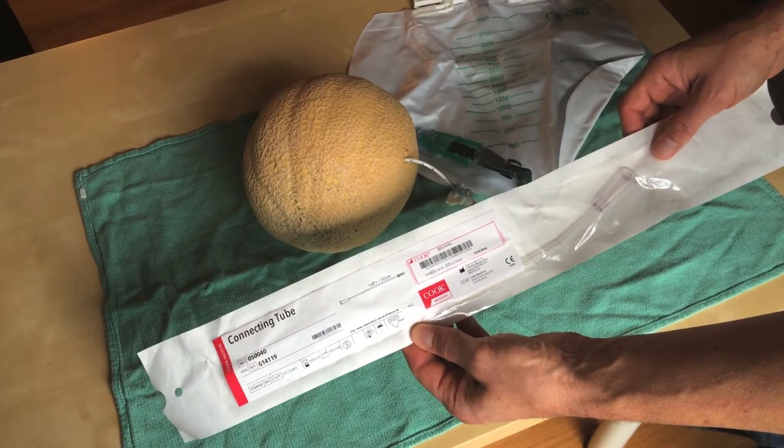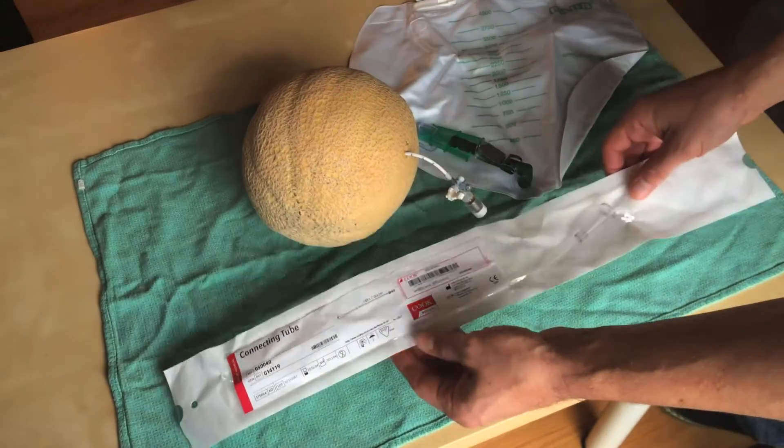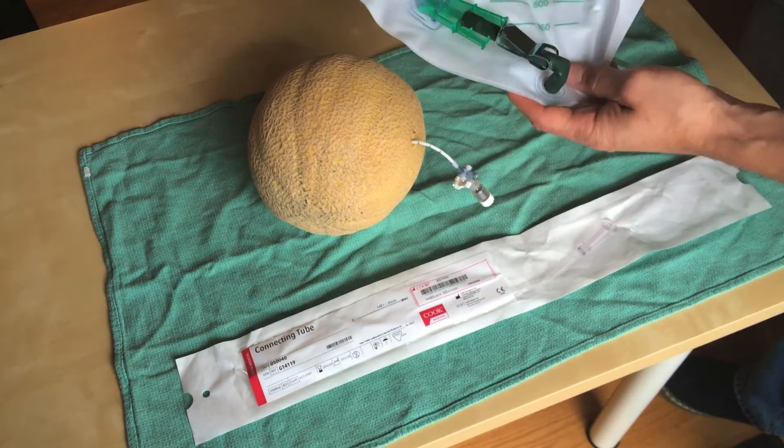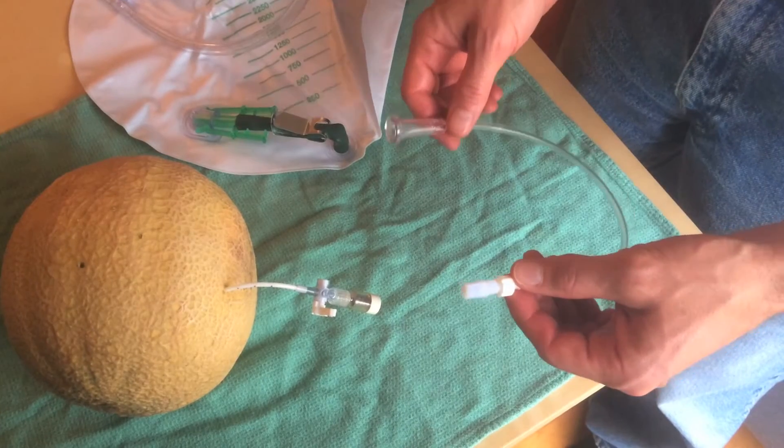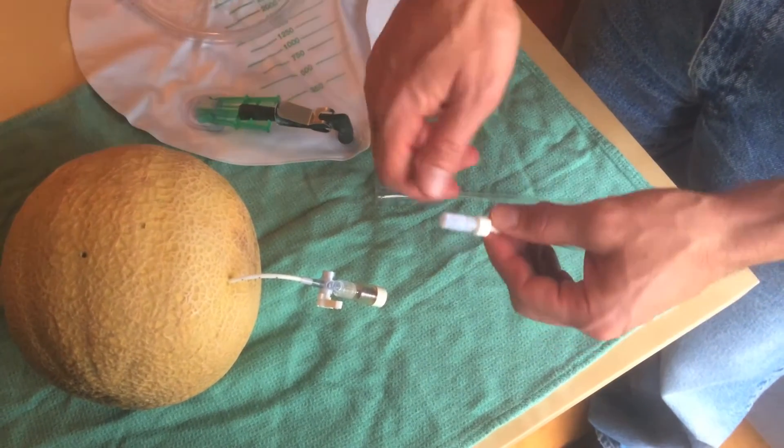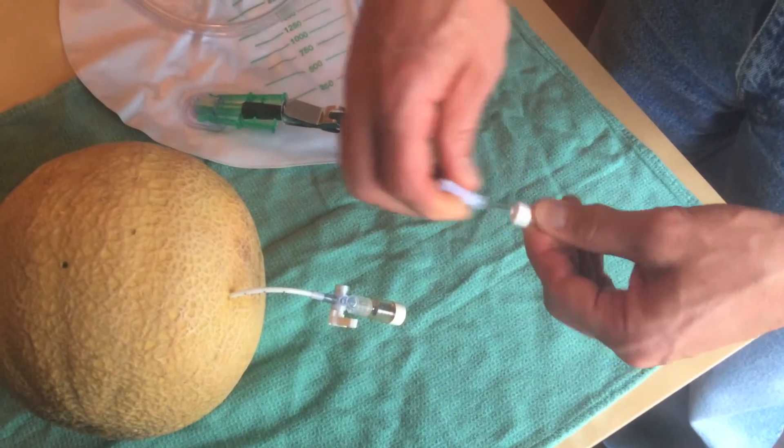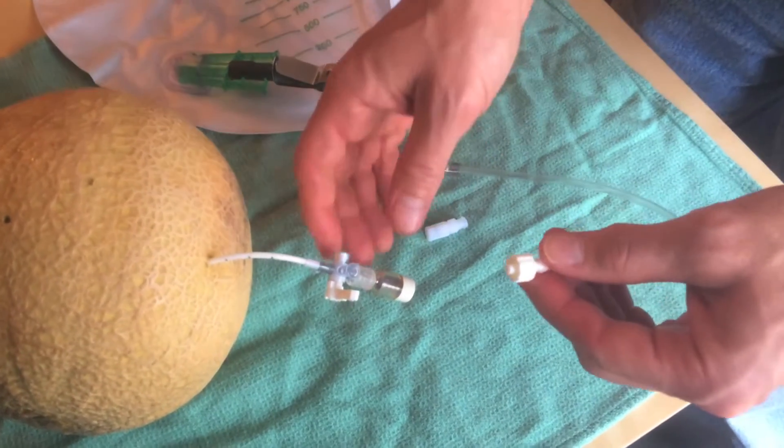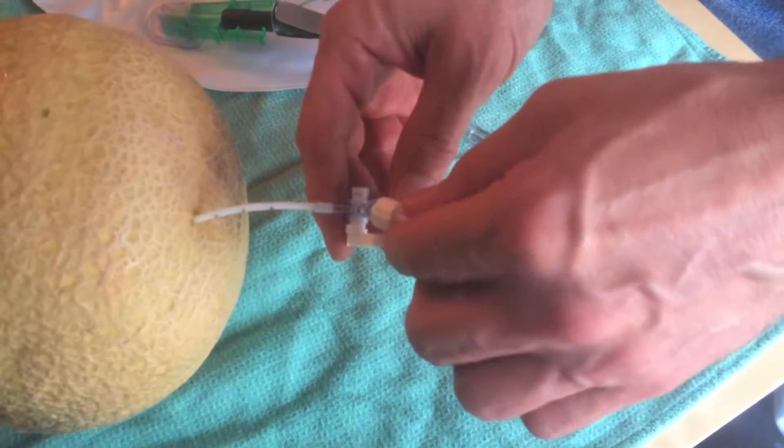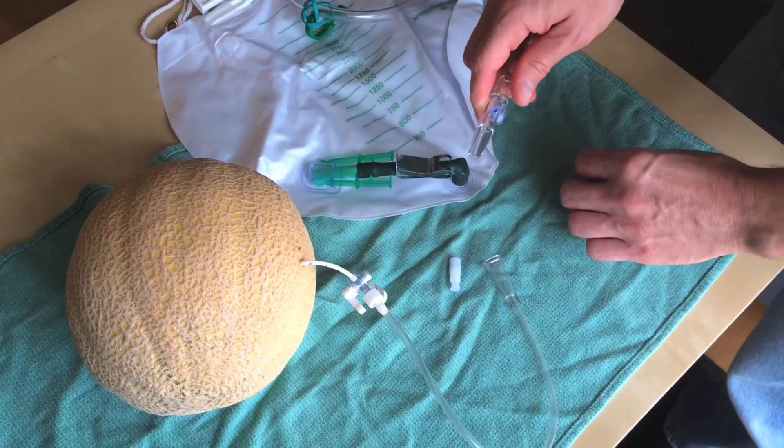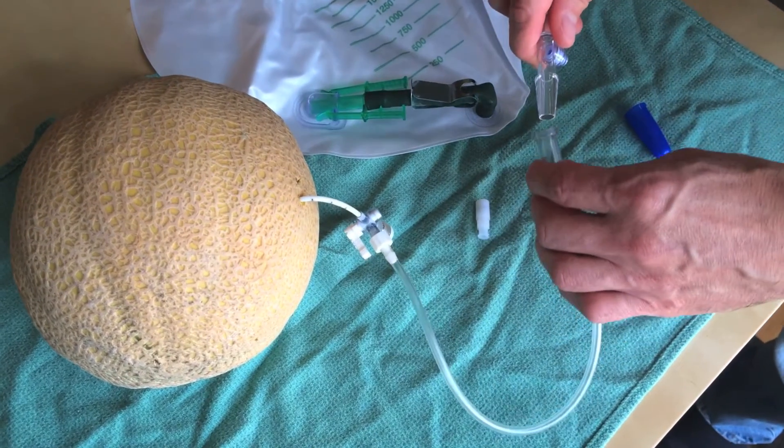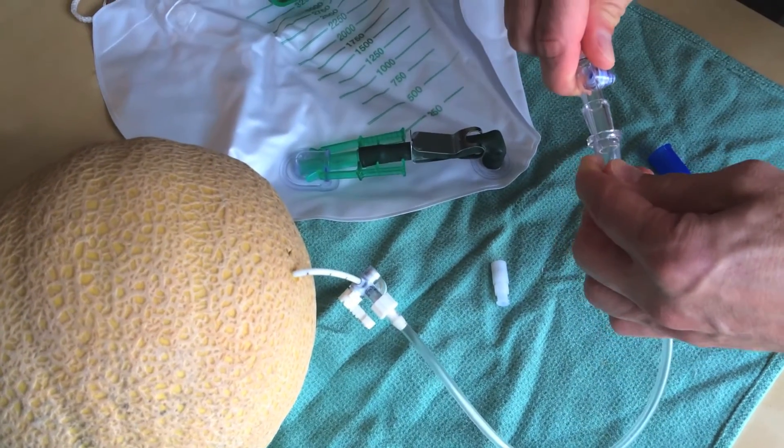The second option for drainage is to use a connecting tube and a Foley drainage bag. Take the connecting tube, remove the cap from the luer lock and attach the connecting tube to the stopcock using the luer lock. Take the tubing from the Foley drainage bag and attach it to the other end of the connecting tube.